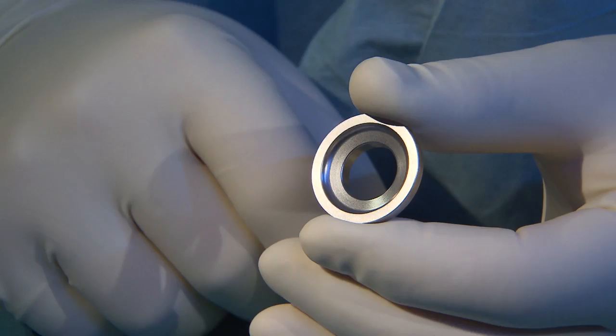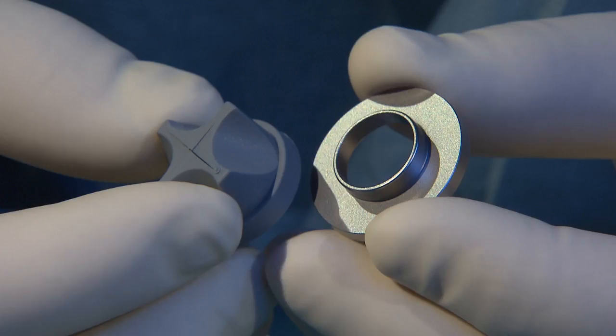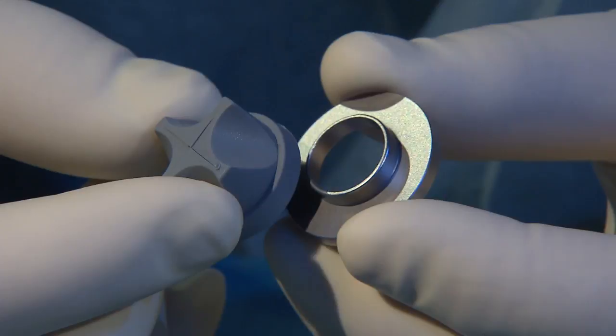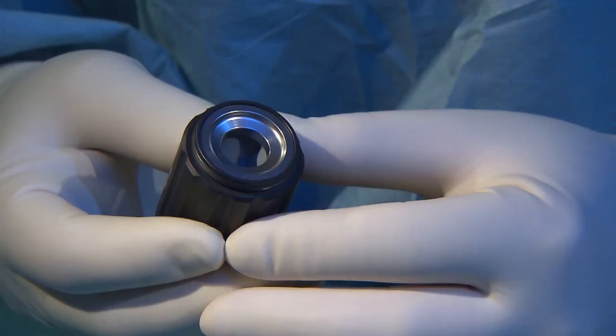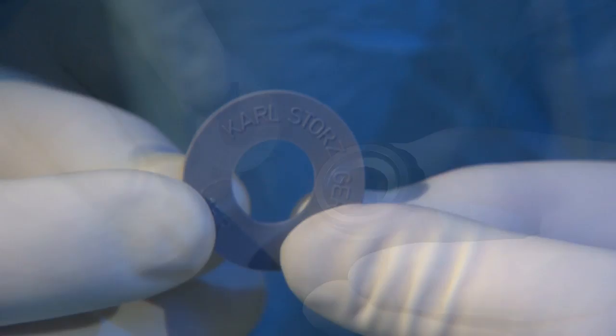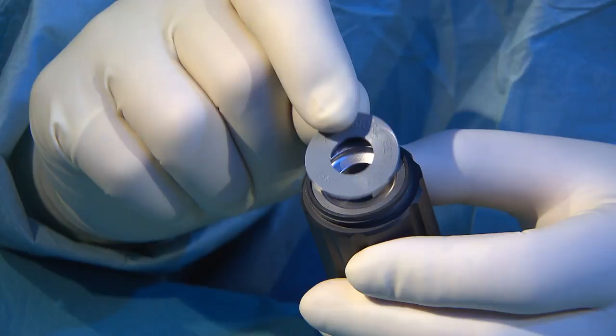The first rubber seal is inserted in the adapter behind the sealing ring, where it prevents gas from escaping from the abdomen. Then the second rubber ring is inserted. Depending on individual requirements, a 10mm or 15mm model should be used.